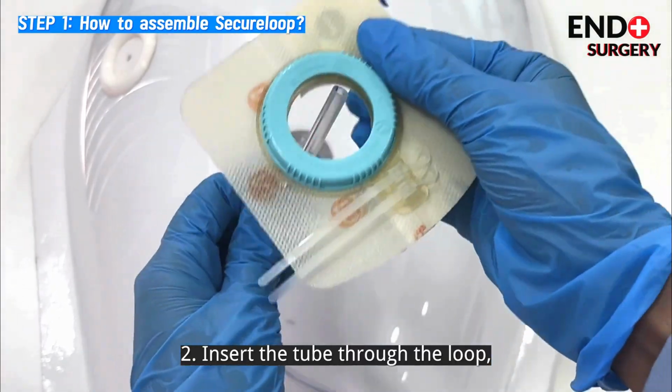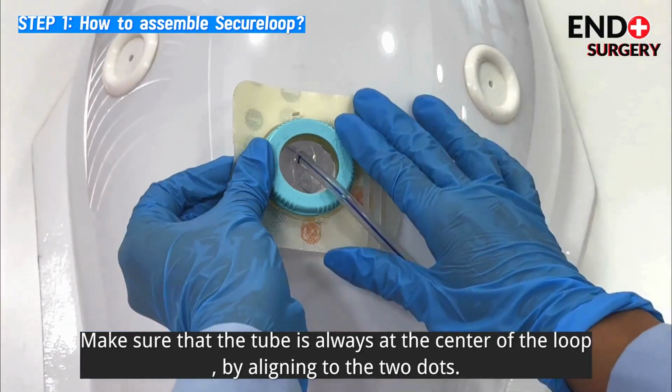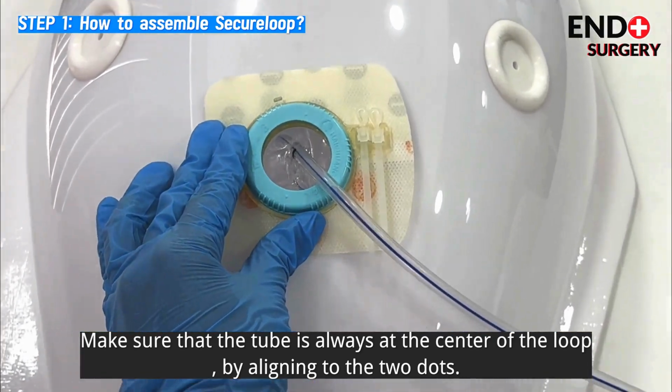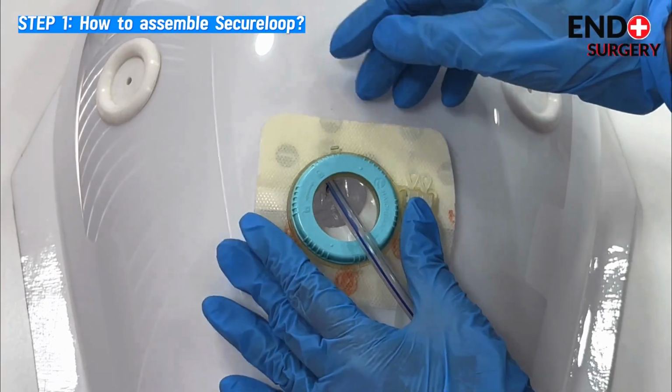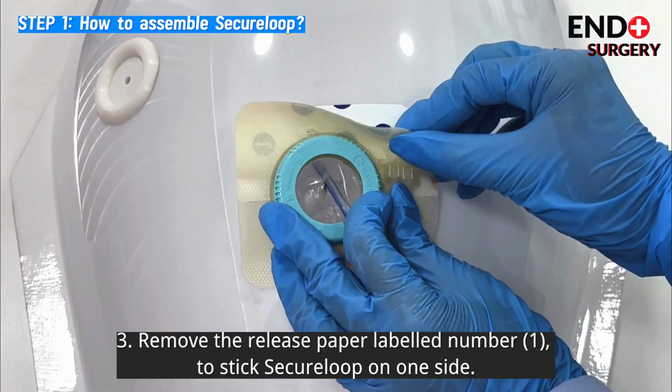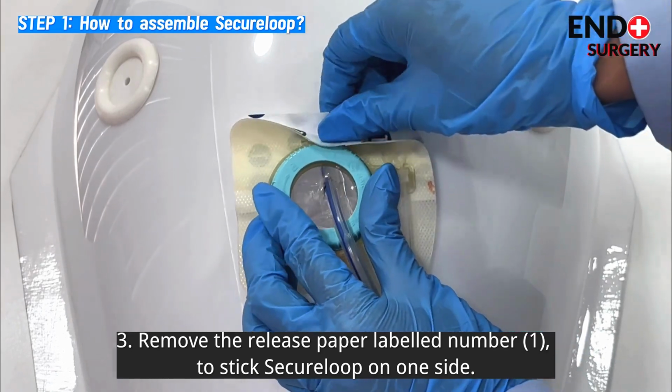2. Insert the tube through the loop. Make sure that the tube is always at the center of the loop by aligning to the 2 dots. 3. Remove the release paper labeled number 1 to stick SecureLoop on one side.